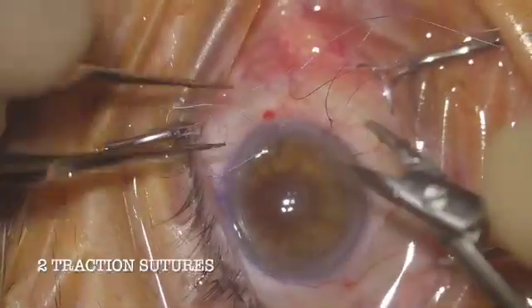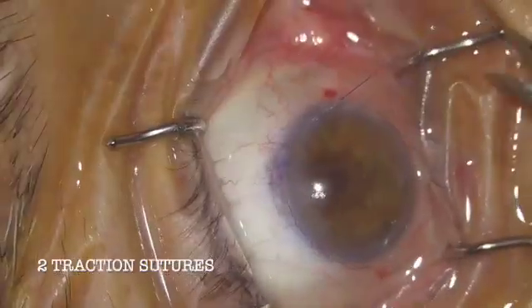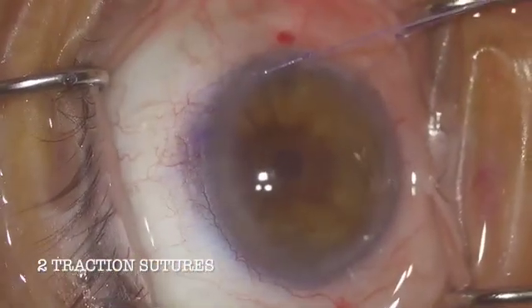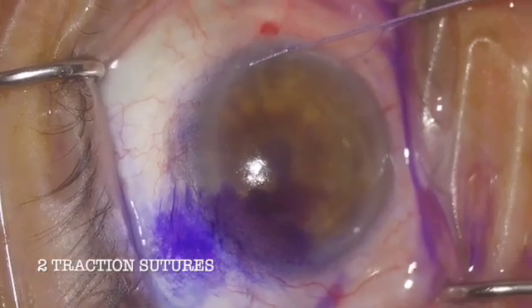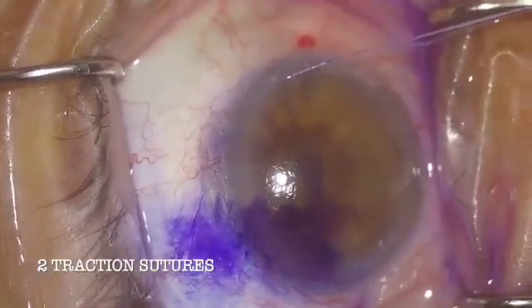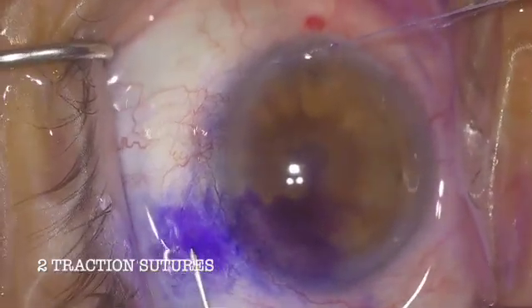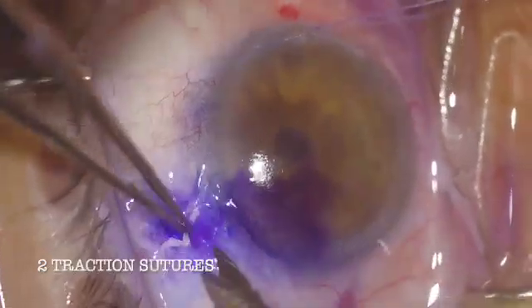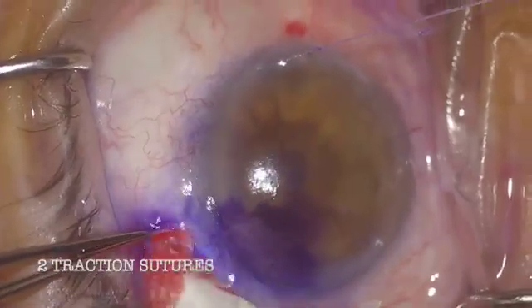With this approach there are minimal sutures and the blebs last a really long time. Senior patients sometimes have built-in anti-metabolites from their chemotherapy, and patients with malnutrition or Crohn's disease — these higher-risk patients actually do pretty well with the ab interno Xen procedure because their blebs last so long. If we can get a Xen stent placed in the superior part of the conjunctiva, it will often just last forever.